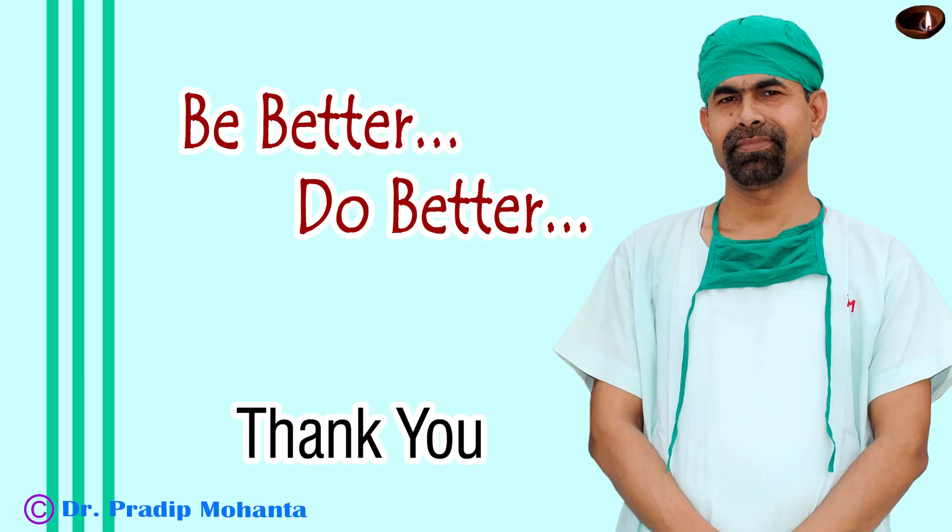Thank you very much for your attention. Hope this video will help you in learning the divide and conquer technique — the basic technique with which every fresh postgraduate eye surgeon should start phacoemulsification. You get to know your machine, you develop your foot control, you develop your hand movements. This is the basic technique for learning phacoemulsification.